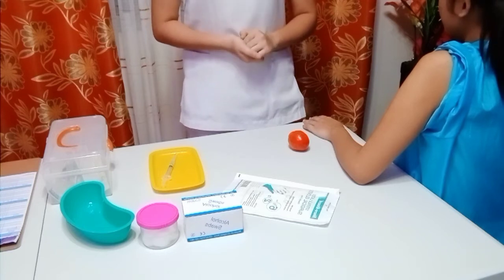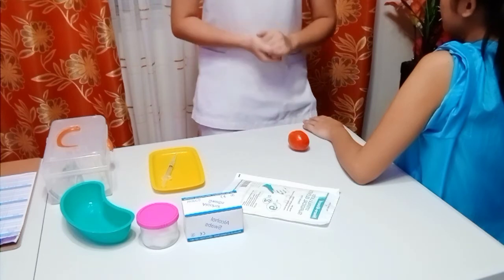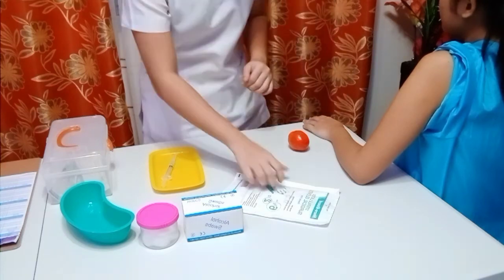Next is to put on clean gloves. But since I don't have clean gloves, I will use sterile gloves instead.